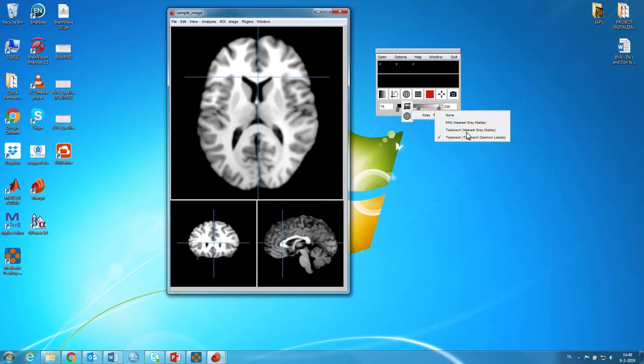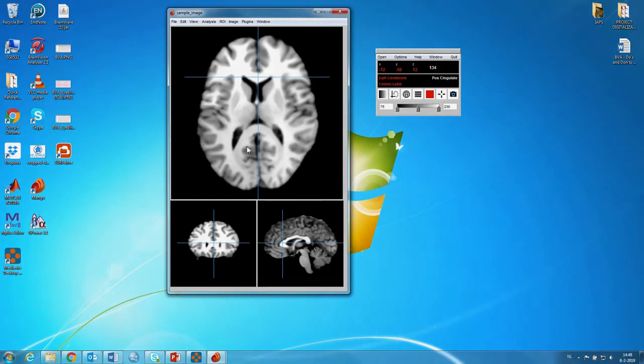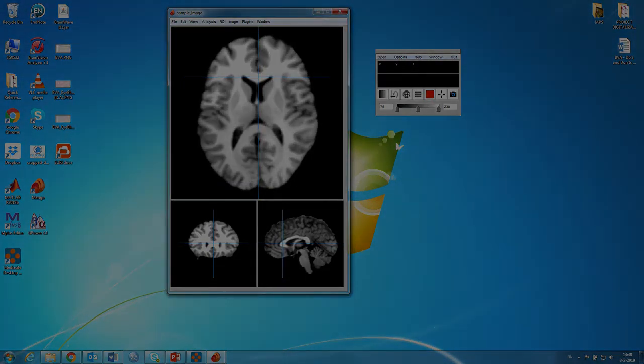And you can select different atlases. Okay. I hope this is helpful. Enjoy scrolling around in the brain. Bye bye.